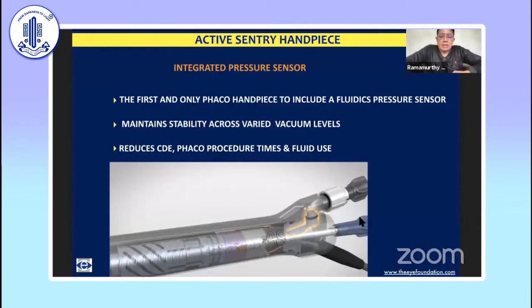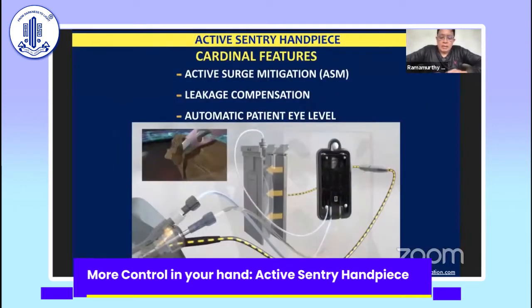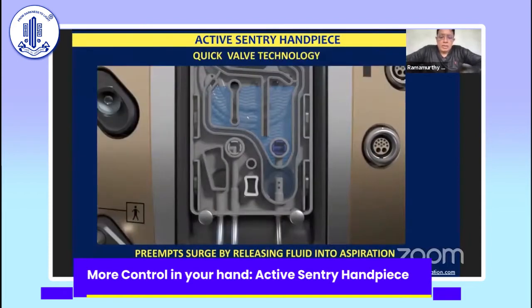So what exactly is this Active Sentry? It's nothing else but an irrigation pressure sensor that has been incorporated in the proximal end of the phaco probe, because of which there is a continuous maintenance of stability even across varied vacuum levels. And this reduces the cumulative dissipated energy, phaco procedure times, and fluid usage, and this I will be emphasizing in my presentation. So there are 3 cardinal aspects as far as Active Sentry is concerned. What is it that it brings to the table? One is active surge mitigation, leakage compensation, and automatic patient eye level so that you do not have to make any kind of adjustment. What exactly are these things about?